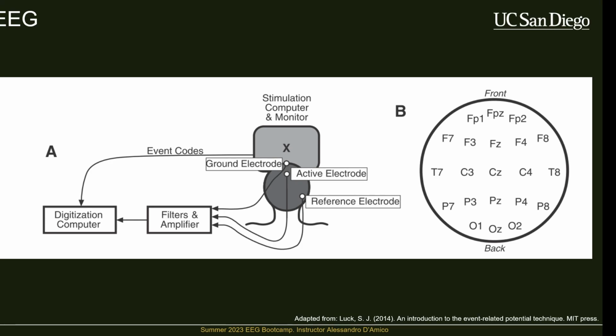A photosensor is a generic term for a class of three different common components: a photoresistor, photodiode, and phototransistor. Most of the time we're using photoresistors, and essentially when the photoresistor is stimulated with light, its resistance goes down. And so you can record when this thing has been presented with a bright flash.